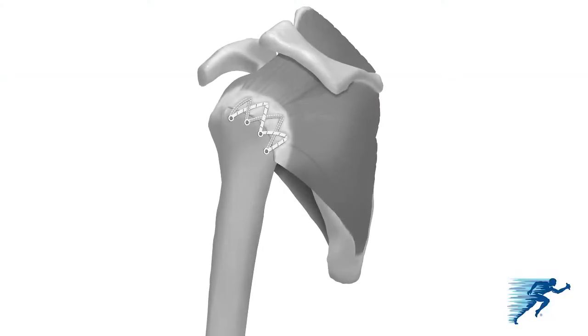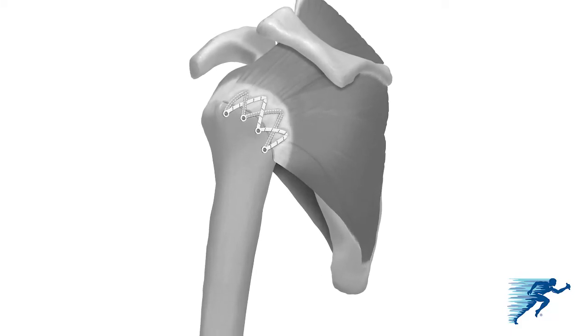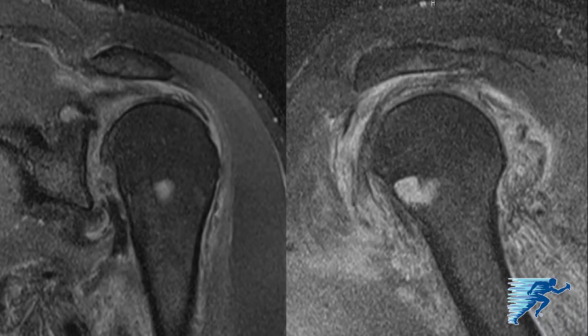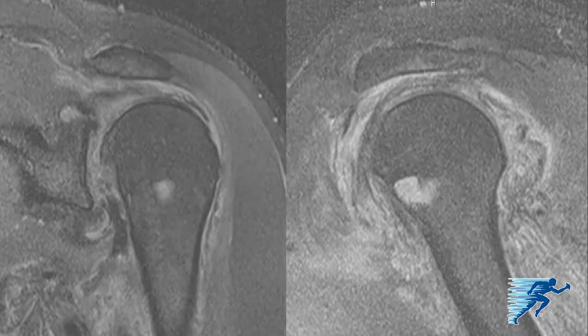This instructional video demonstrates arthroscopic knotless double row extended linked repair of a massive posterior superior rotator cuff tear. The patient is a 56-year-old gentleman with an acute massive posterior superior rotator cuff tear involving the supraspinatus, infraspinatus, and the upper portion of the teres minor. It's a very large tear that will require a double row repair with an extended linked speed bridge construct.